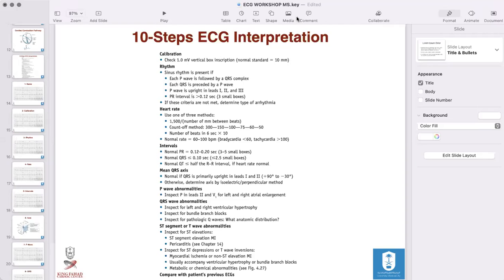A good question. So sometimes patients have had a heart attack before, a myocardial infarction. For example, let's say in the anterior leads, they have Q waves, ST elevation, then they go through the evolution, they change with the T wave and the ST. Some of them have persistent ST elevation. Let's say they have a large infarct or an aneurysm, and then they have baseline ST elevation on discharge from the hospital, about 1 millimeter.